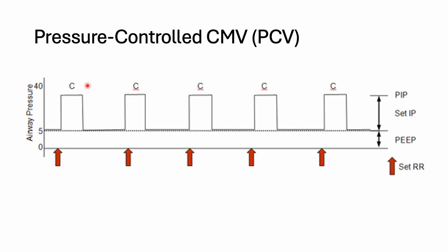What does this C stand for? C stands for control. Okay, just labeled here to illustrate that this graph is for pressure controlled ventilation. Do you always see the C on each ventilator graphic? Not necessarily. Okay, and when we go through the labs and look at this on the mechanical ventilator, you would then know every machine has different interfaces. Okay, so they represent things slightly differently. Okay, so this is a controlled mode.